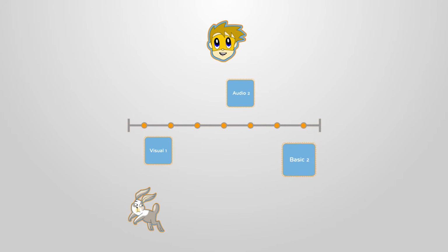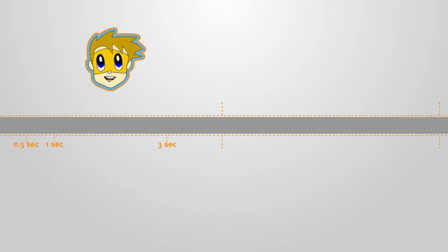Let's zoom in and take a look at a segment from the test. Each element, for example, a target, can appear for a different length of time: half a second, 1 second, or 3 seconds. Then, a blank screen or void appears for the same length of time as the element. Let's examine how the attentive indices are measured.